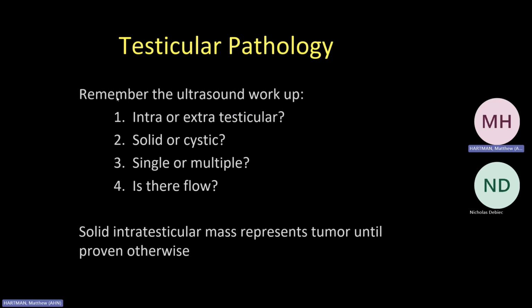So testicular pathology. Remember the ultrasound workup. You have a lesion. Is it intra or extratesticular? Is it solid or cystic? Single or multiple? And is there flow? Remembering that a solid intratesticular lesion is tumor until proven otherwise.